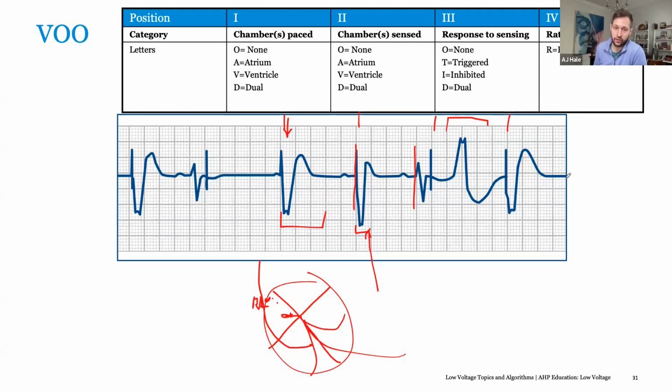If the patient's going in for surgery, electrocautery can cause a device to withhold pacing. So if you have a dependent patient who is going in for a shoulder surgery, for example, that electrocautery could confuse the device that this intrinsic noise here is actually a QRS complex, which will reset a timer on a pacer. It will wait and withhold a pace.